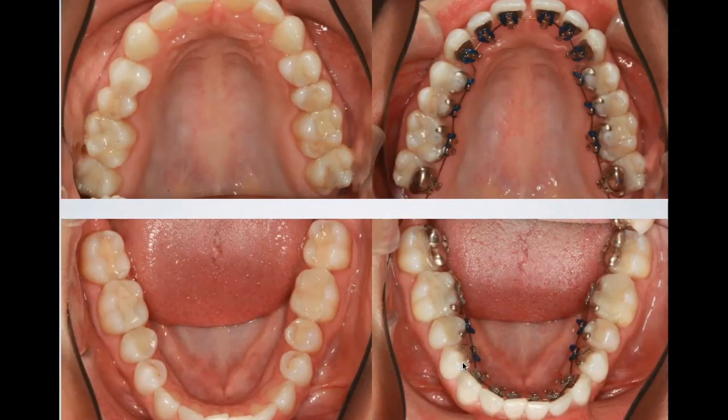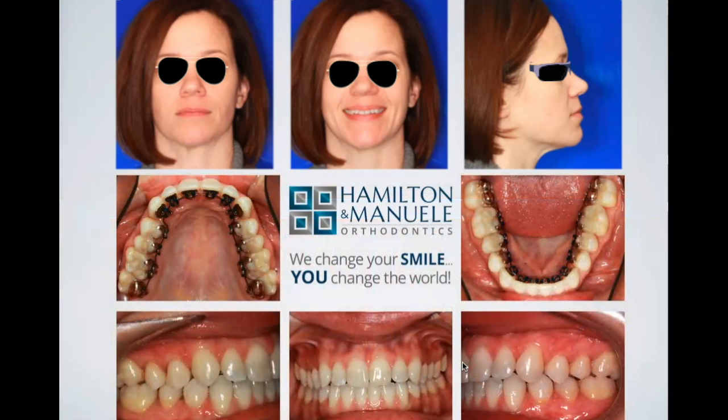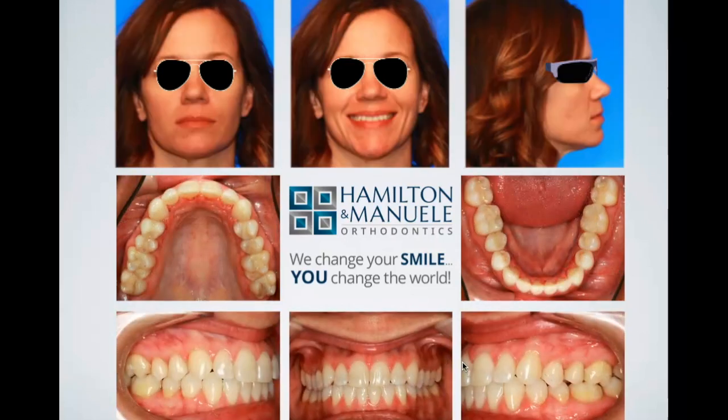You can see, like I was talking about, flossing is kind of a nightmare. But she wore them. She loved having them behind her teeth. You can see just by leveling, we did get a little bit more in size of display, but that's definitely something I would have had a longer conversation about. If we could have increased her smile display another 2 or 3 millimeters, that would have been a really nice change if that's something she wanted.